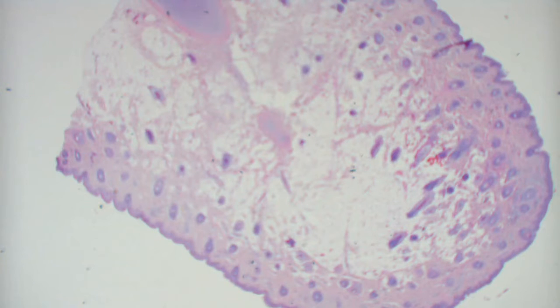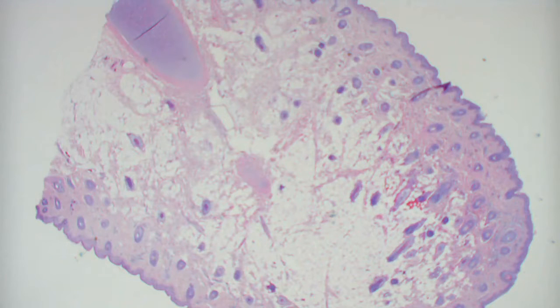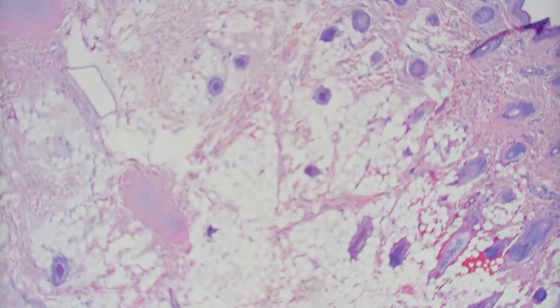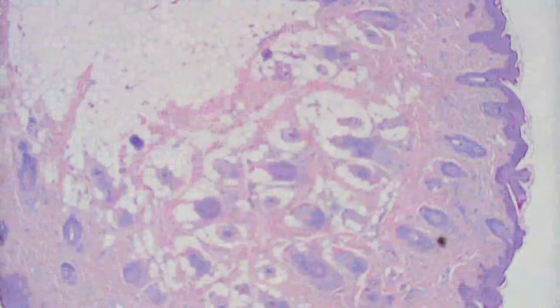This is a dome-shaped papule, and we can see that it has multiple vellus hairs. There's fat in the center of it. There's also cartilage, so accessory tragus. Yeah, accessory tragus. Now, do you have to worry about the patient? Usually if it's an isolated lesion on the face, no, I wouldn't worry too much about it, but I would look around and do a really good physical exam to make sure there are no other branchial arch abnormalities. That'd be the one thing that, if you get one of these, they can sometimes have other abnormalities that are associated with branchial arches, branchial clefts.